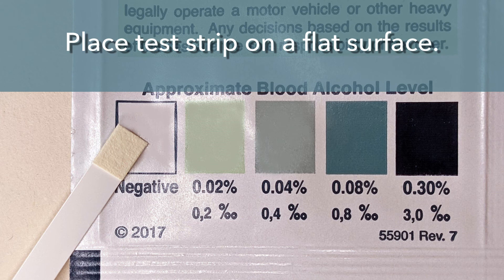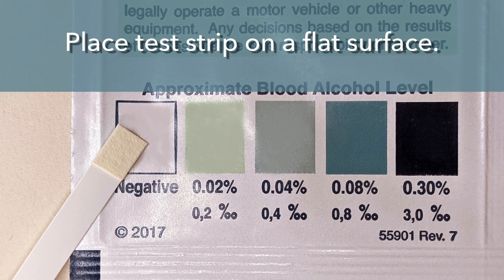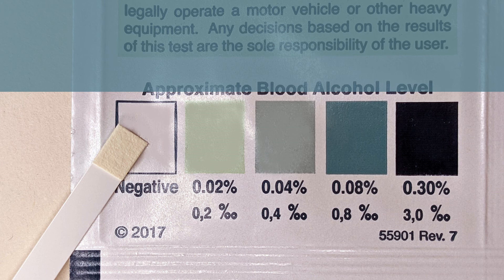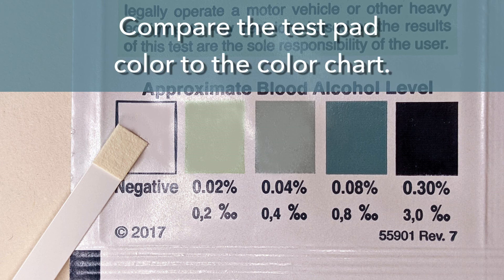After 5 seconds, place the test strip on a flat surface. Start a 2-minute timer. At 2 minutes, read the results by comparing the color on the test pad to the color chart on the back of the test packet.